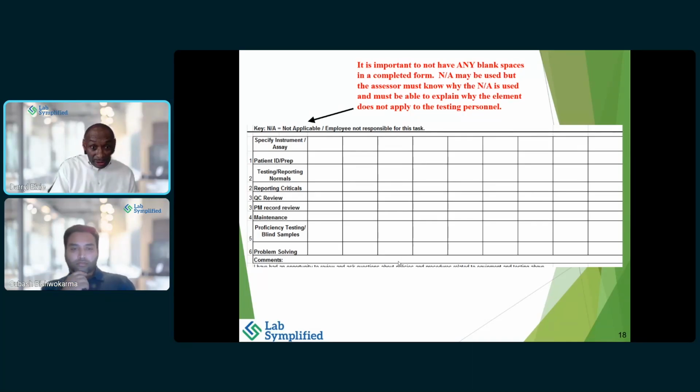We go back and look to make sure, because QC, and we all know QC is so important. Everybody should know how to do QC because the instruments break all the time. If you get it back up, what do you have to do to get it running? You've got to do quality control. So we can all agree that you should know how to do quality control and also how to evaluate it. That means all of these should be filled in.